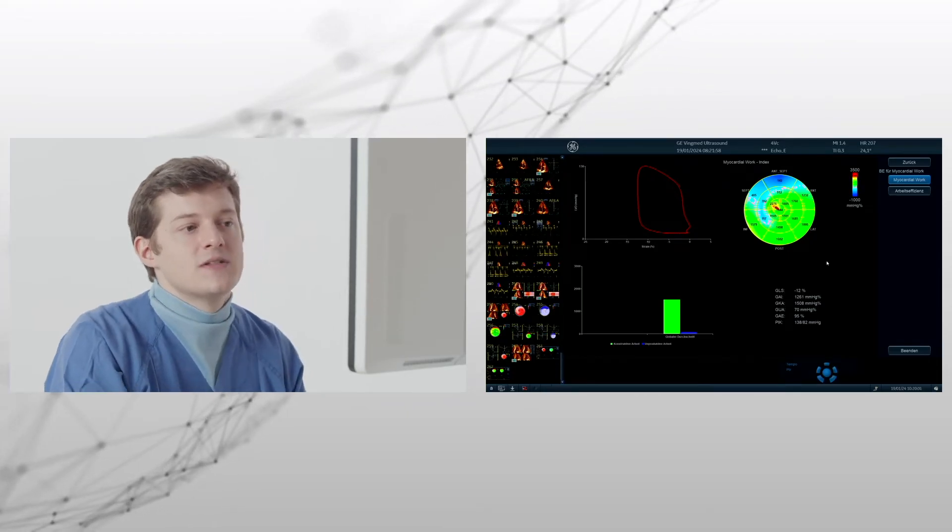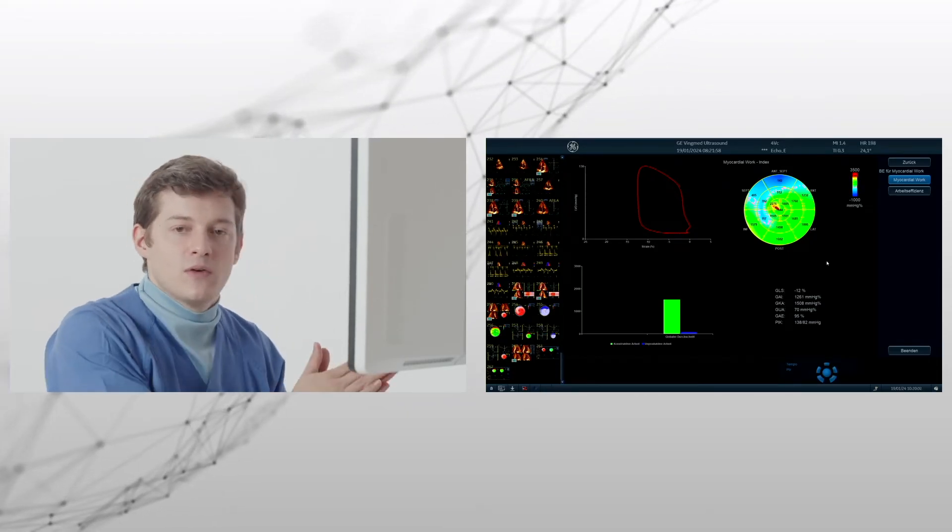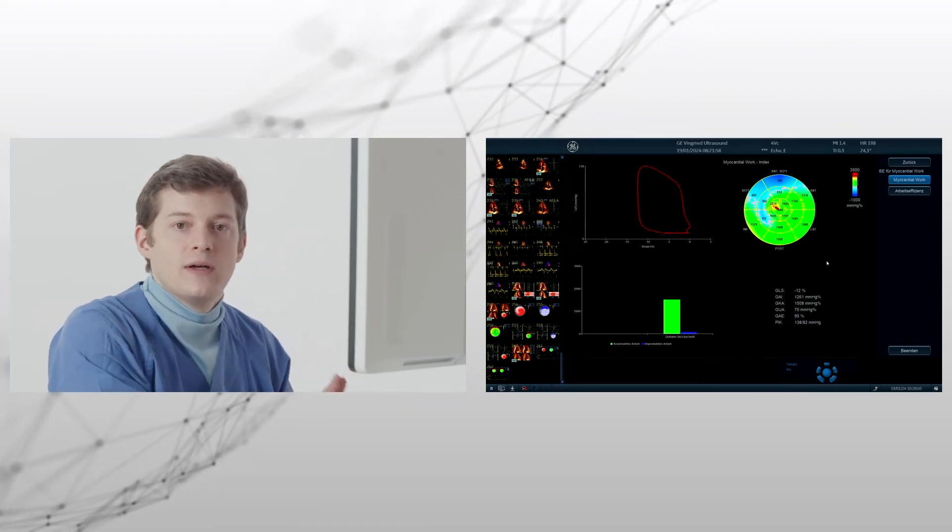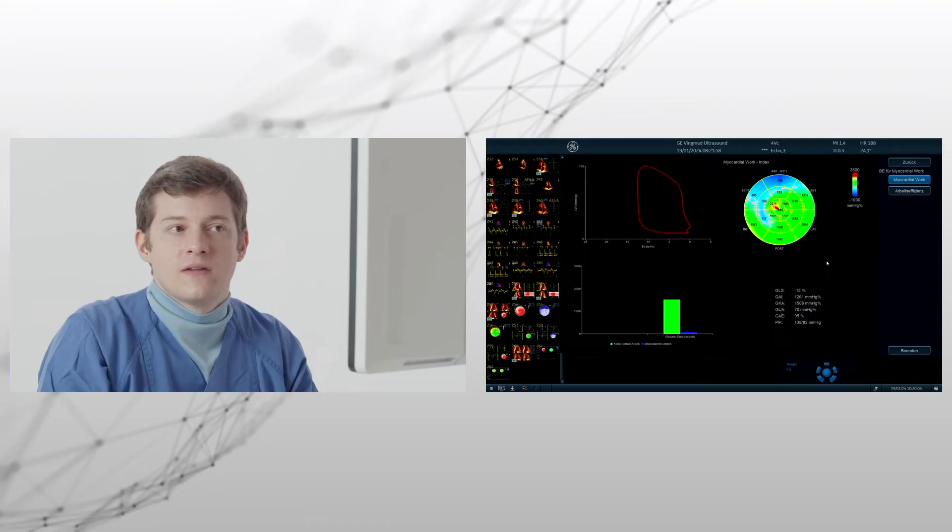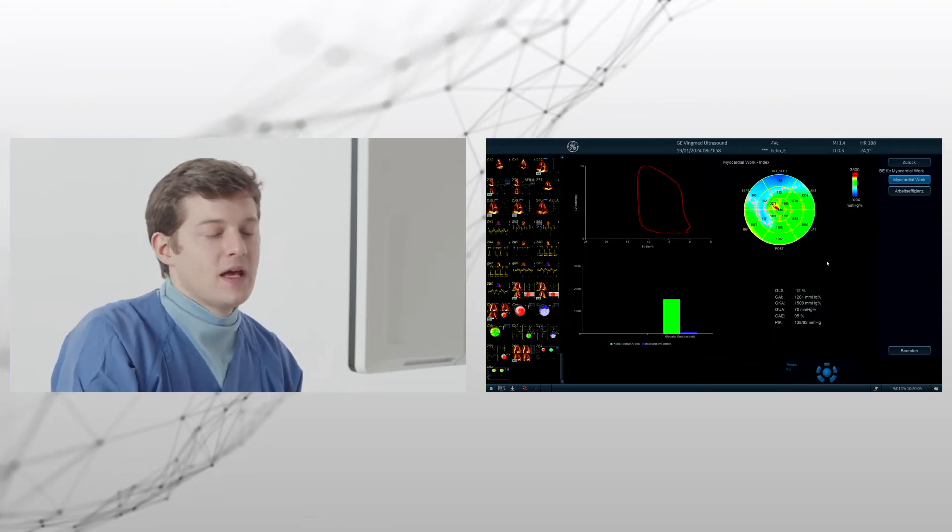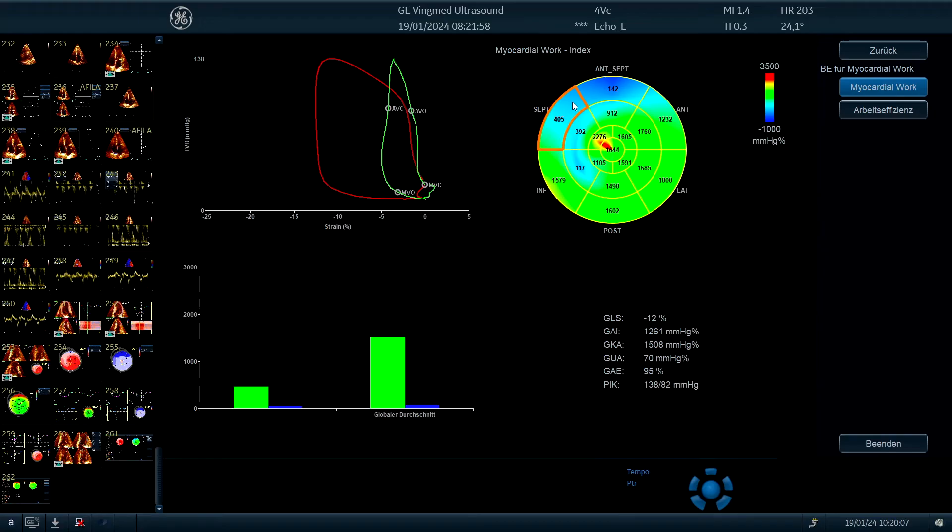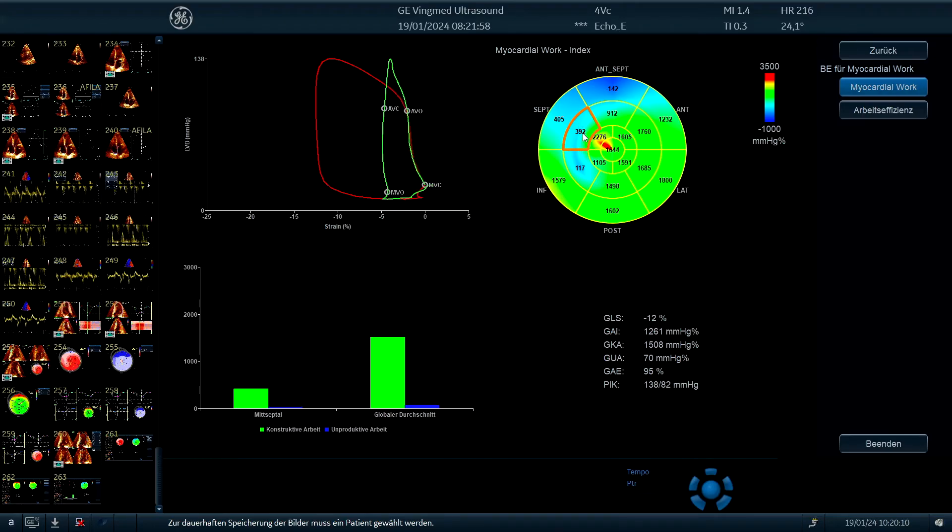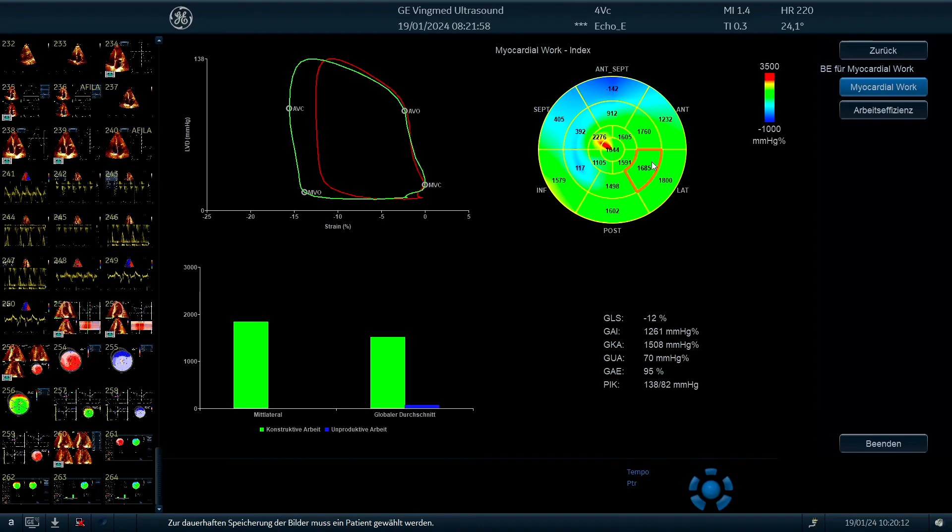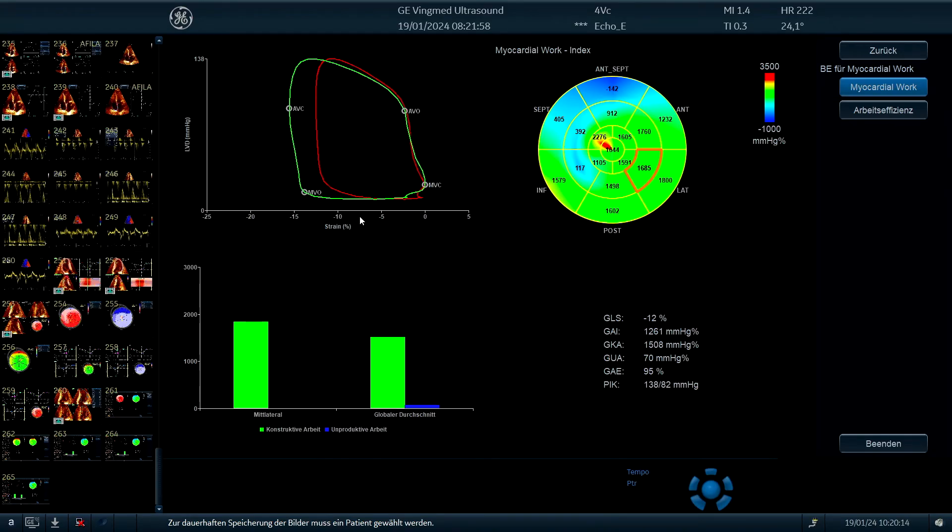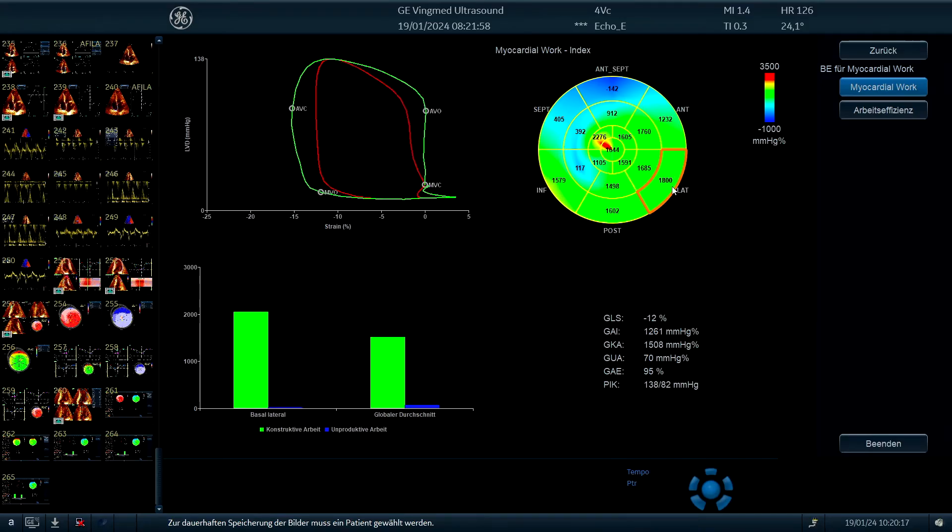So this is a millimeter of mercury percent evaluation, because it's strain plus the blood pressure. And here we can see the various situations where you have the strain pressure curve. And here it is normal, you can see that quite nicely.